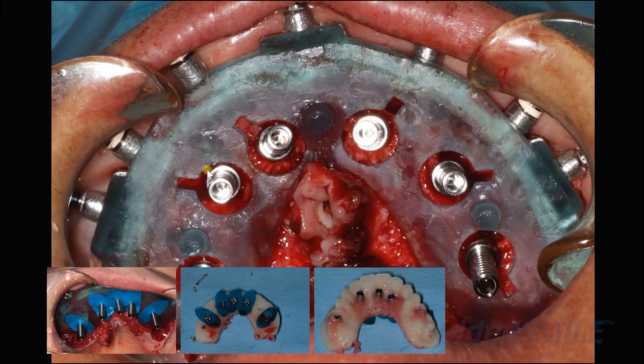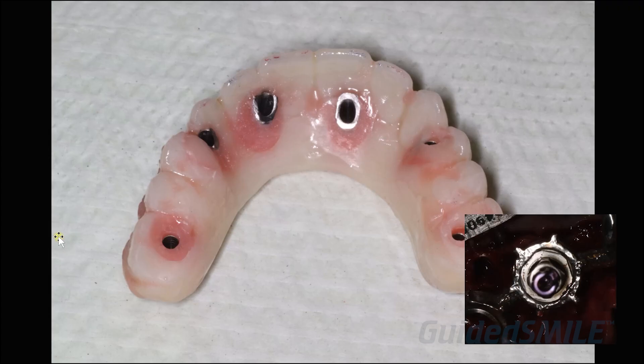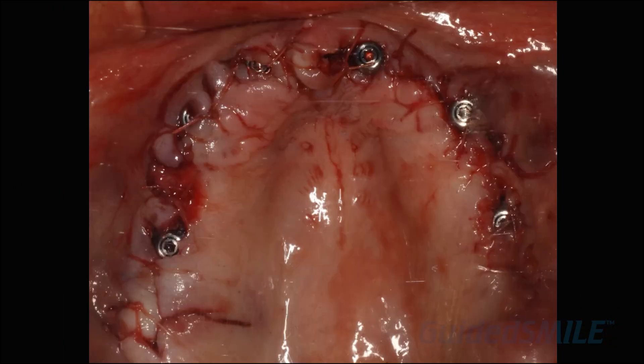You'll seat the gaskets on each of the temp cylinders, then seat the prosthesis, and backfill around each temp cylinder with the stellar luting material, hit it with a light, remove it, and take it back to the laboratory. The prosthetic pickup is pretty straightforward: gaskets, prosthesis, blue plugs, backfill, remove, go back in the lab and do the conversion. You'll pick up two prosthetics — one with the white lingual, which is the rapid appliance, and one with the pink lingual, which is the prosthesis the patient wears home. The patient is sutured and waits while the assistant does the conversion.